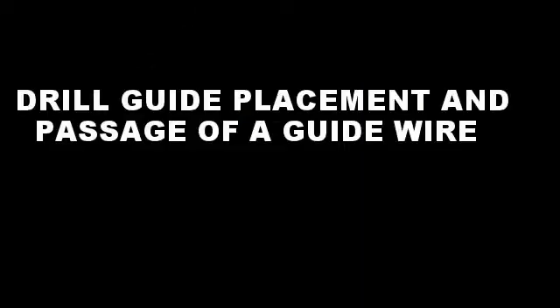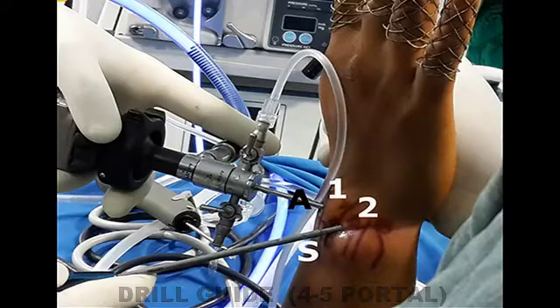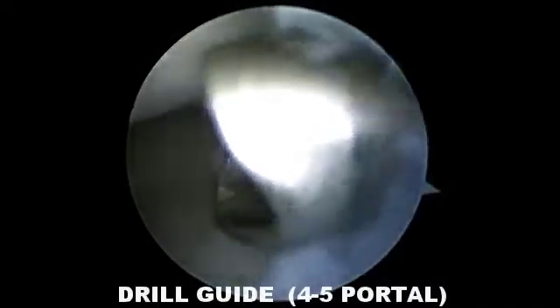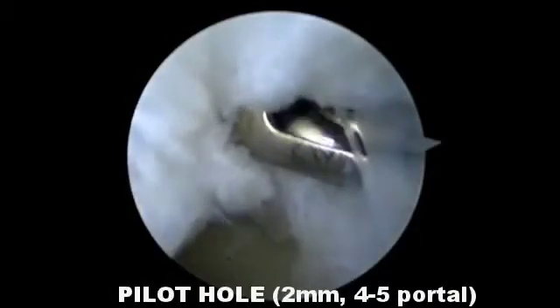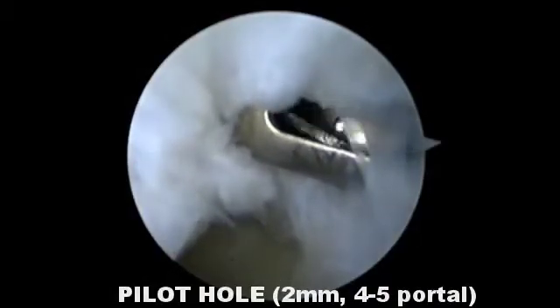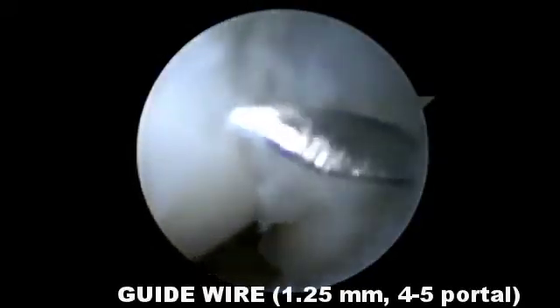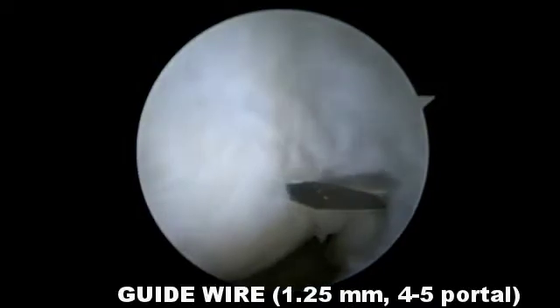A drill guide is passed through the 4-5 portal and is positioned on the dorsal surface of the lunate. A 2 mm drill bit is passed through the guide and a pilot hole is created in the dorsal cortex of the lunate. A guide wire is then passed through the sheath into the pilot hole and drilled into the lunate.